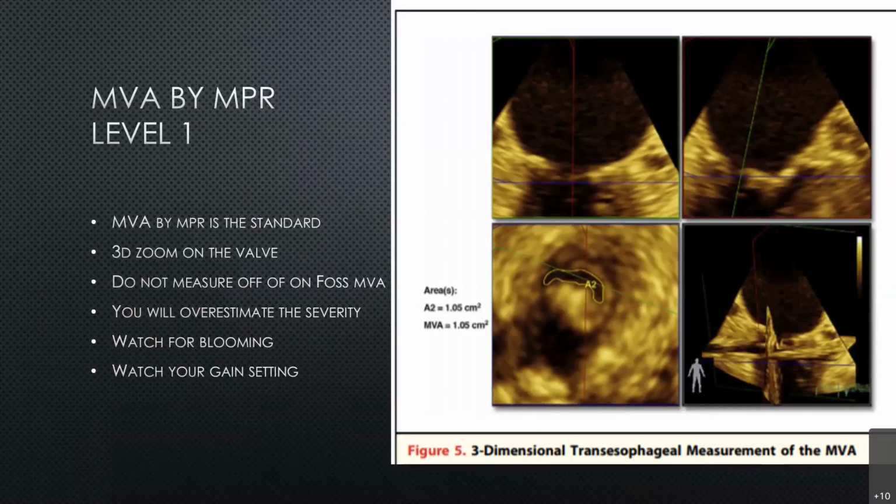And again, this whole mitral apparatus, it's a funnel, right? The two leaflets will come down as a funnel. So you don't know which plane you're cutting at, say on a 2D image. So ideally, you want to zoom in, you want to get a good 3D, where both your annulus should be present, and then in a multiplanar reconstruction get the mitral valve area. So you adjust all three planes to get to the mitral valve leaflet tips and calculate your area there. So this is MPR, and this is the best way to get planimetry of the valve.